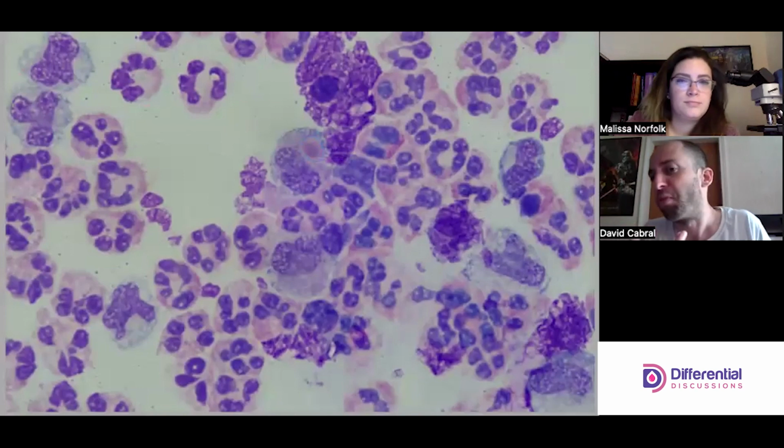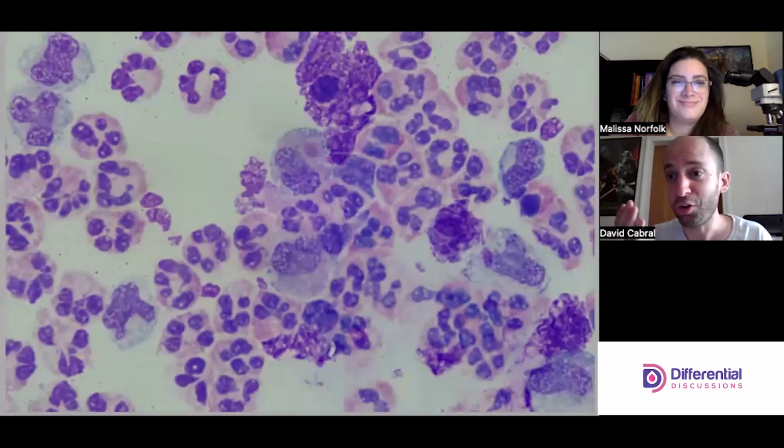It looks like it was probably a white cell to me. And we have a really cool word for that. Leucophagocytosis is what we might say as a qualitative comment. And to me, what that expresses to the clinician is that these cells didn't just get there yesterday. This fluid accumulation, this effusion, whatever it might be, has been going on for a little while.